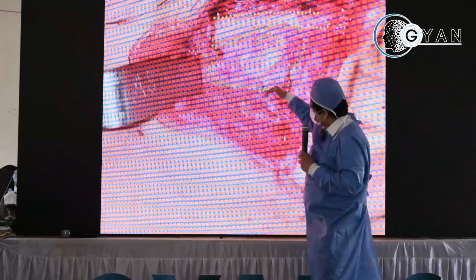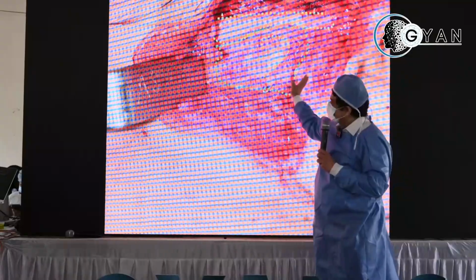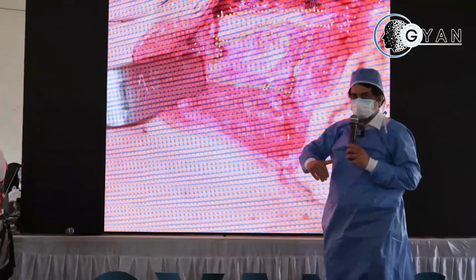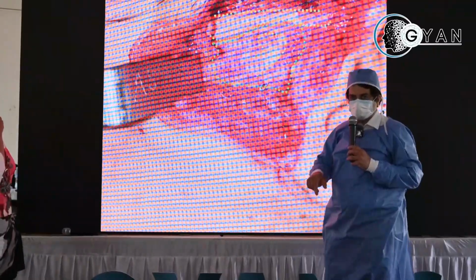So once you push it downward, just as I told you yesterday also, you just have to take care of the superficial temporal vessels and the branches traveling horizontally here. While dissecting it, while pushing it, take care that you don't damage it. If you damage it, then while ligating them or while controlling them, you can unnecessarily damage the nerve also.